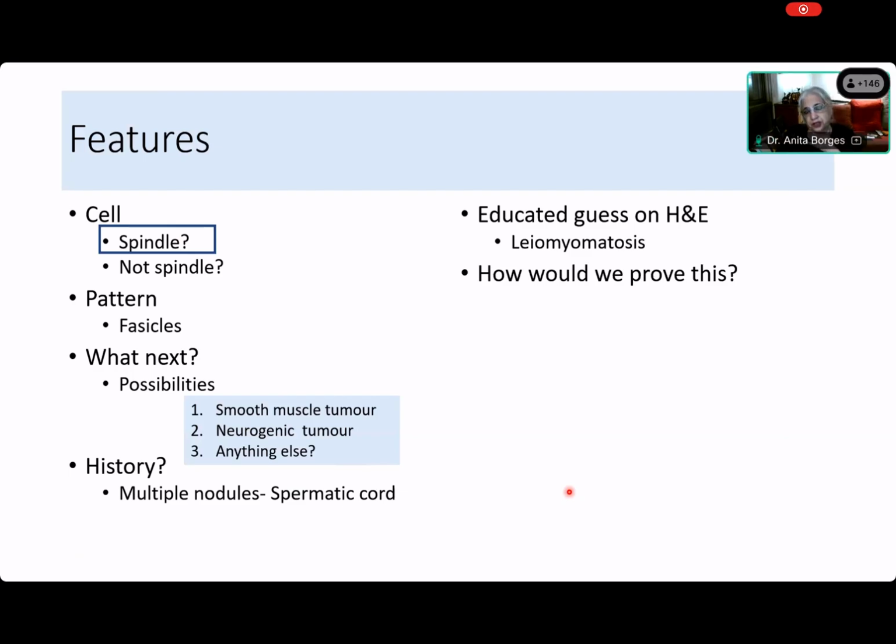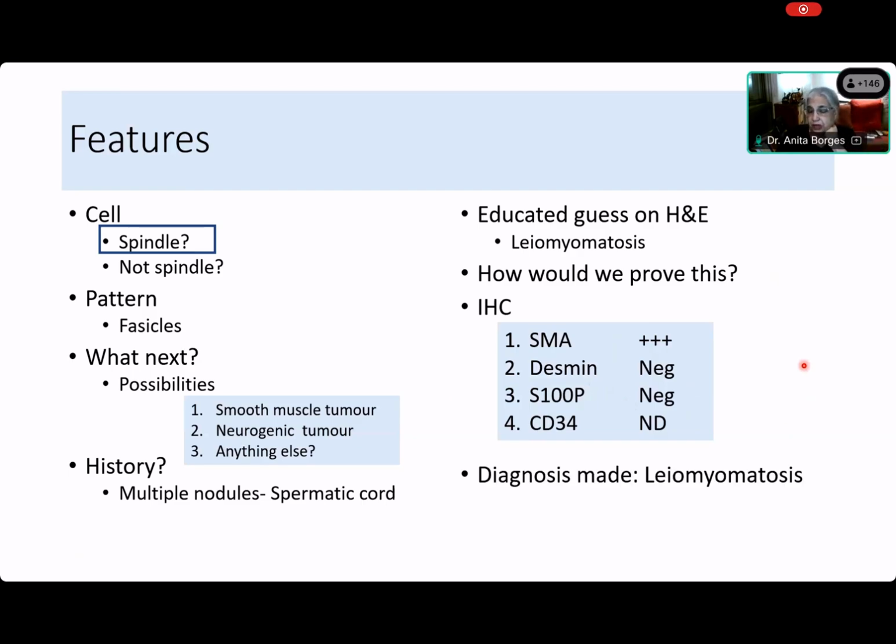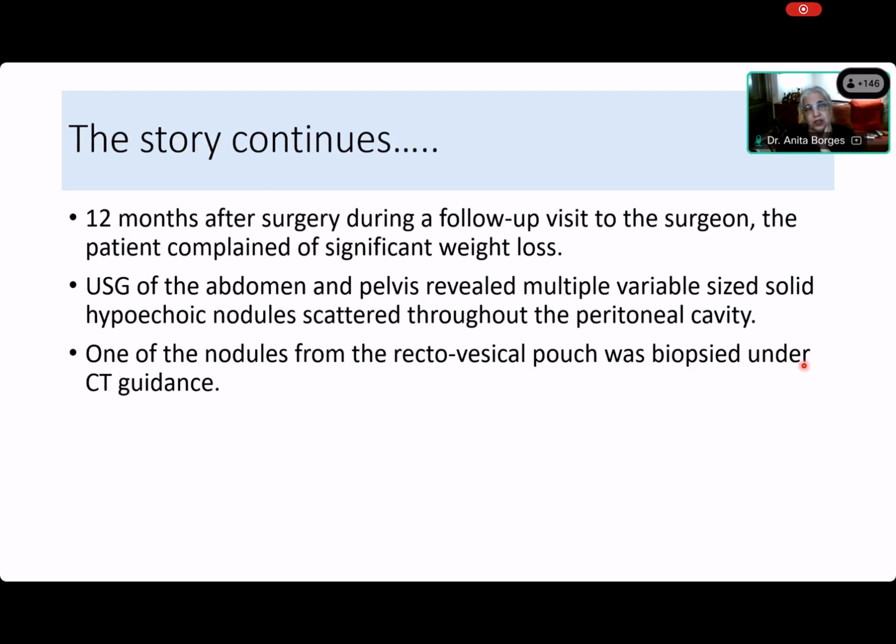So how would we prove this? We should do immunohistochemistry. We should do SMA. Desmin is negative, SMA will be positive. Yes, SMA was very strongly positive. For some reason, whoever looked at this case did not do a CD34. They did SMA, and the diagnosis in their minds was multiple nodules, leiomyomatosis. So what was the diagnosis that was finally given? The diagnosis made was leiomyomatosis. But that was not the end of the story. This patient came back 12 months later because he was losing weight.